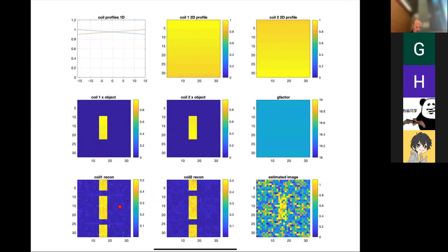And then when I try to create my image, I get something that looks pretty bad. So basically, even though you would think that each image on its own actually looks pretty good, except for the aliasing, because they look so similar, they can't really undo the aliasing. And as you're seeing, it really amplifies the noise background. So what we're seeing is noise amplification.